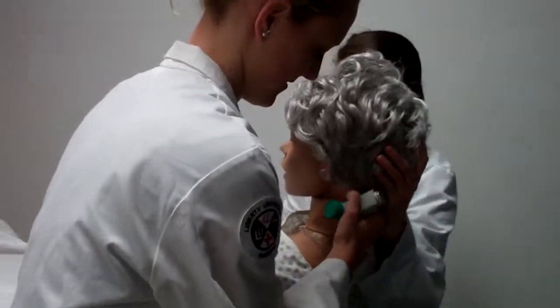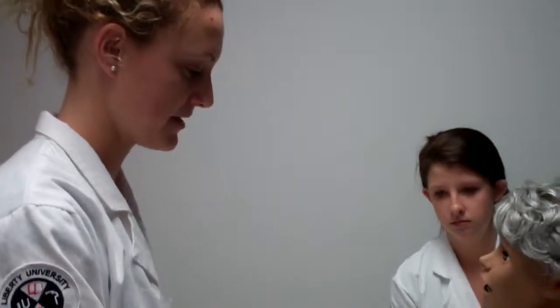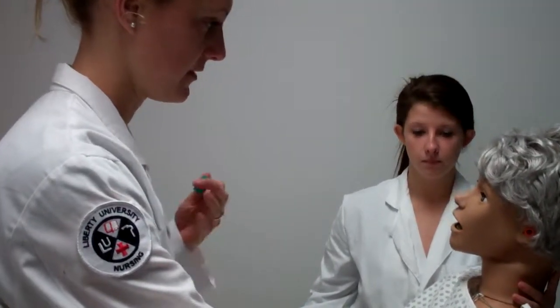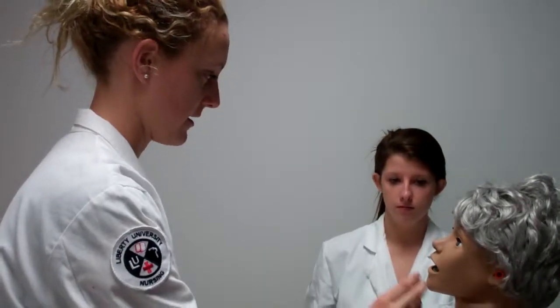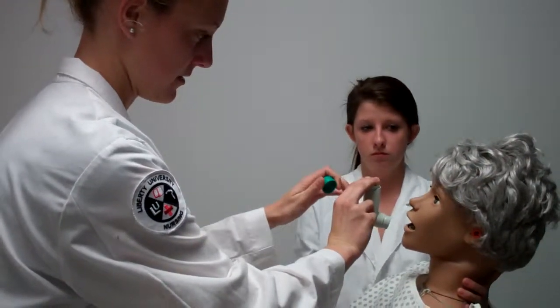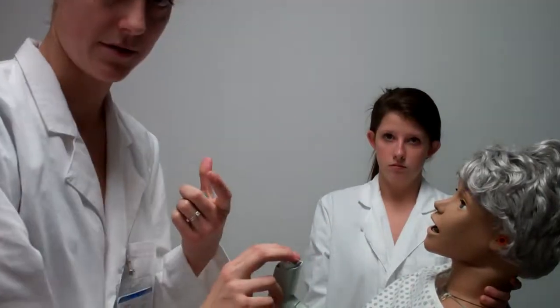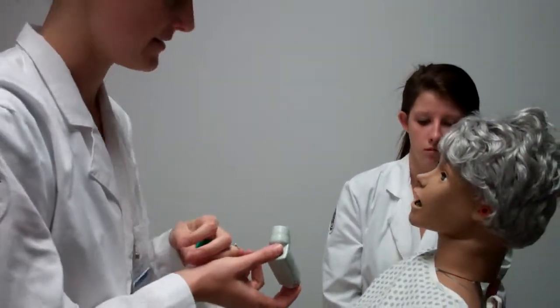I would shake the inhaler and ask the patient to inhale deeply and then exhale deeply. As they're blowing out all the air, and as they start to inhale, I would push the inhaler to administer the dose, and then have them inhale for 3 seconds and hold it for 10 seconds.